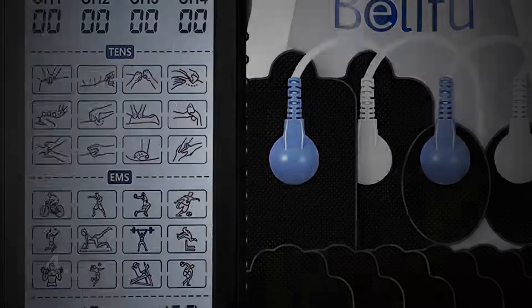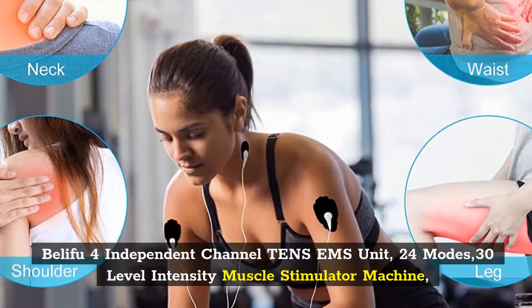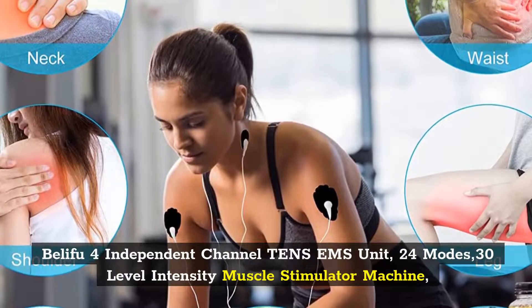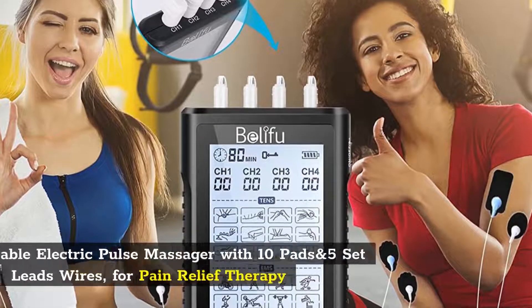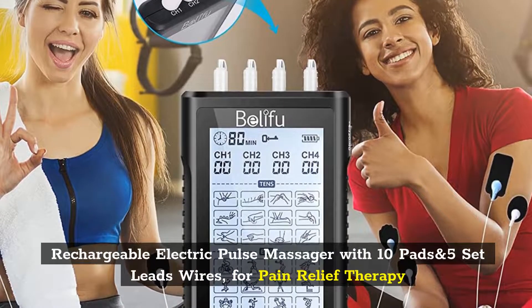Number 4: Belifu 4 Independent Channel TENS EMS Unit, 24 Modes, 30 Level Intensity Muscle Stimulator Machine. Rechargeable Electric Pulse Massager with 10 Pads and 5 Set Lead Wires for Pain Relief Therapy.